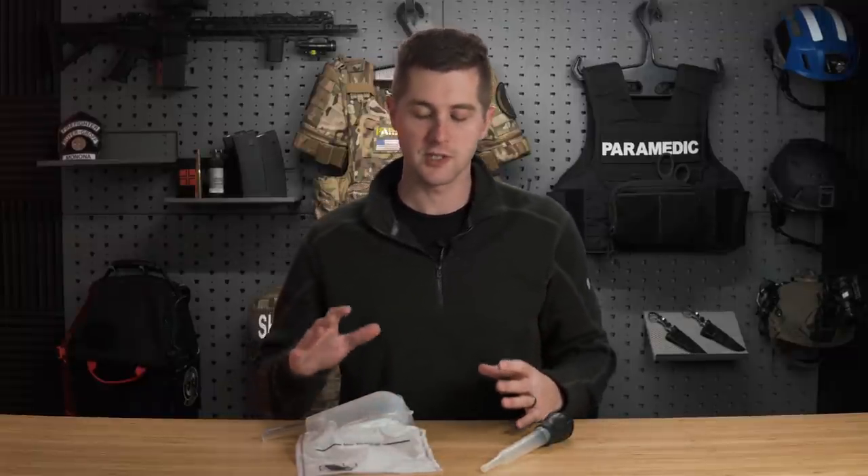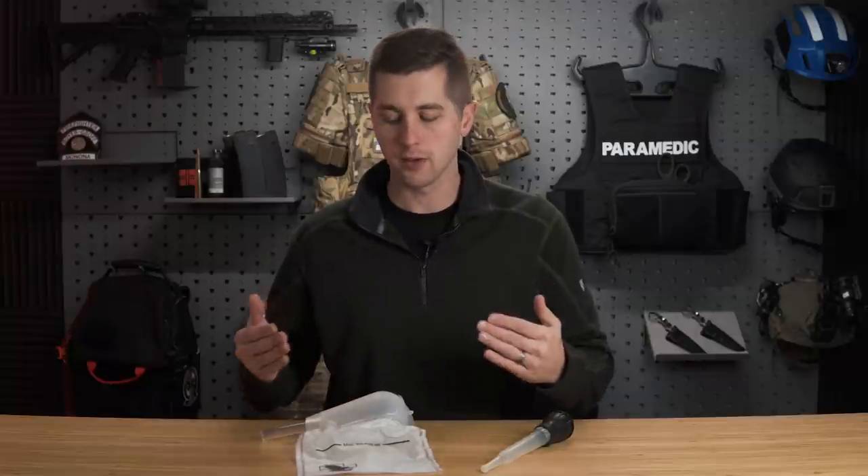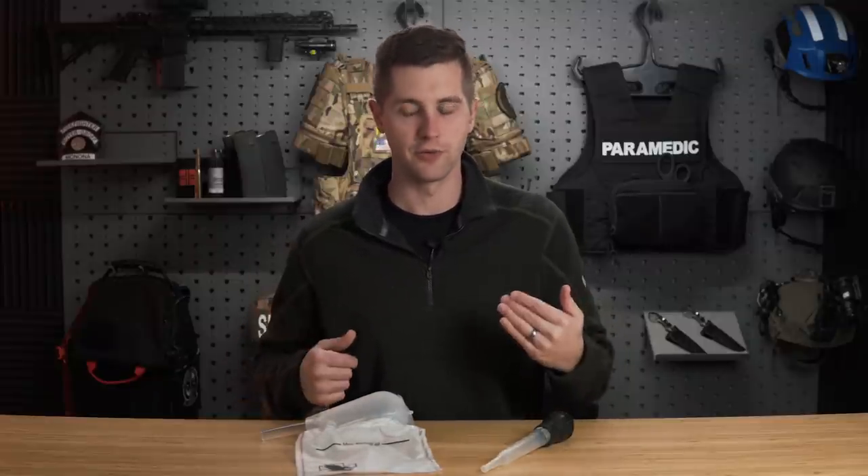When we're assessing a patient in an emergency situation, one of the first things we have to address is their airway. That's part of your ABCs — airway, breathing, circulation. To assess your airway, you have to make sure it's open, and one of the ways we can clear it if there's bile, vomit, or other food stuff in their mouth is with suction into the oropharynx.